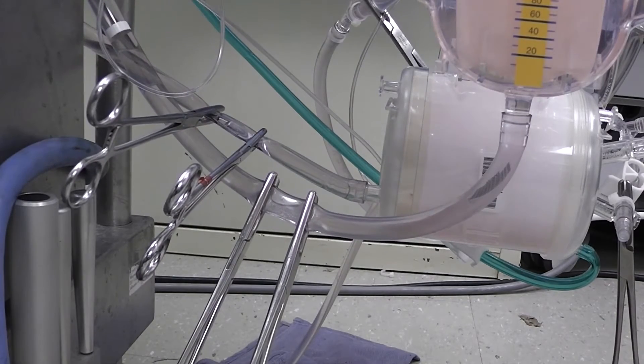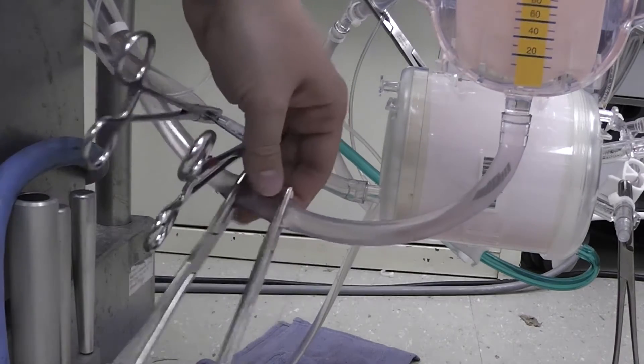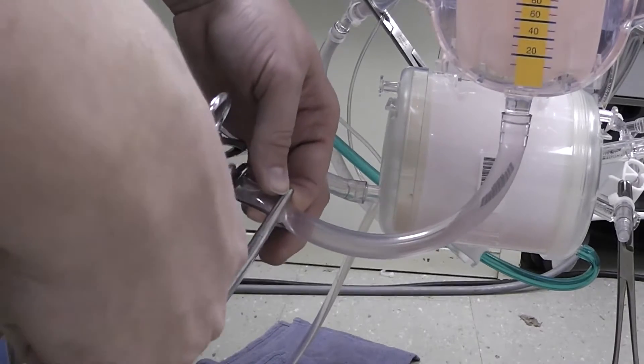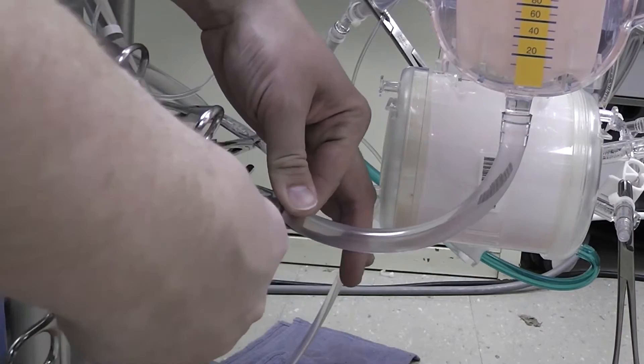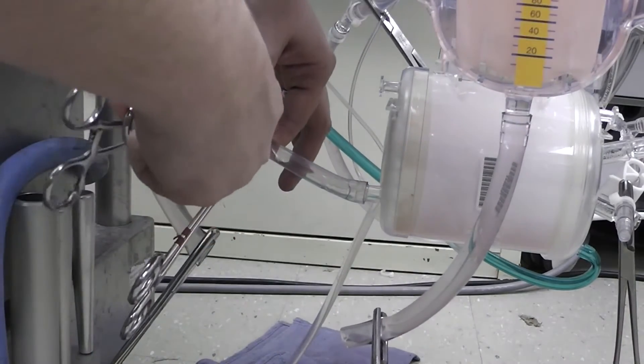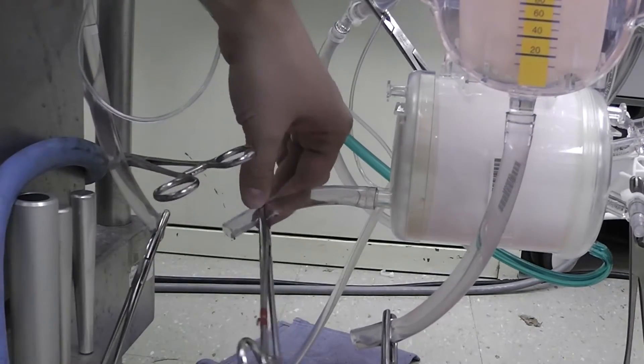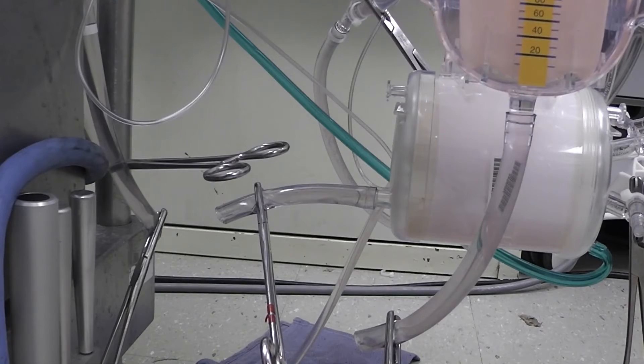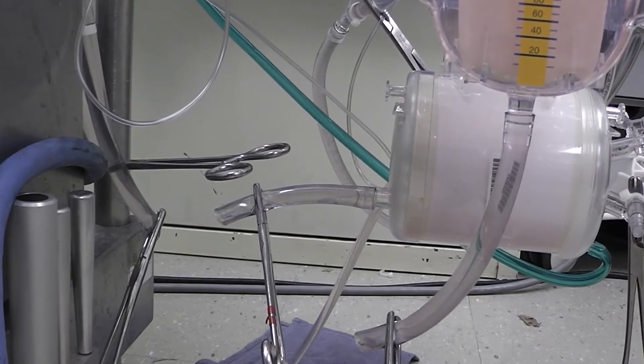Now that we've done that, we're going to use an alcohol or betadine swab on here and we're going to divide this line and do the same for the outlet side. We want to keep those sterile, and now we're going to remove the arterial line from the pump head.